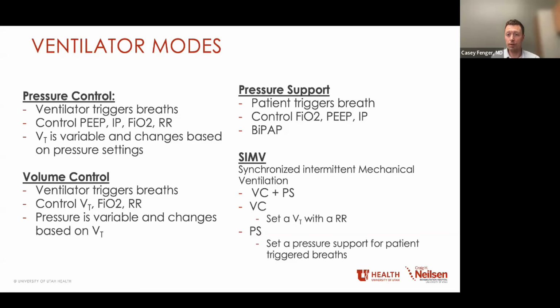Pressure support, what makes the support different from the control is on support modes, the patient has to trigger the breath. And so if a patient's apneic, not breathing, not trying to trigger a breath, the vent's not going to do anything. And what you control is the FiO2, the PEEP, and the inspiratory pressure. This is pretty similar to a BiPAP machine that someone would wear at night.